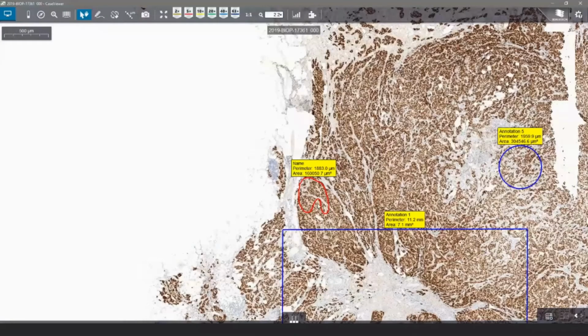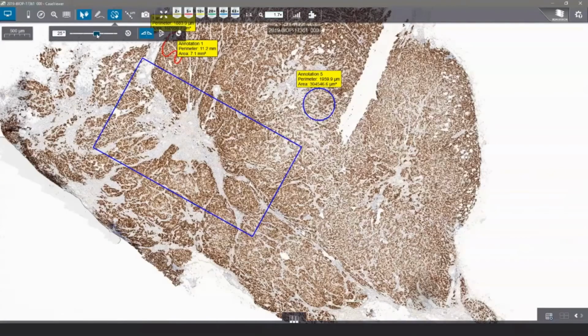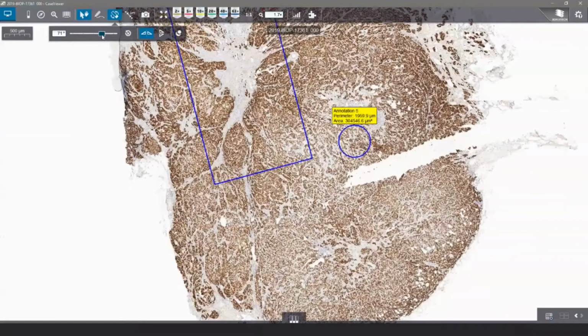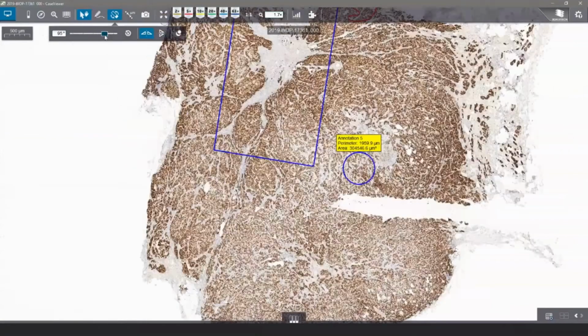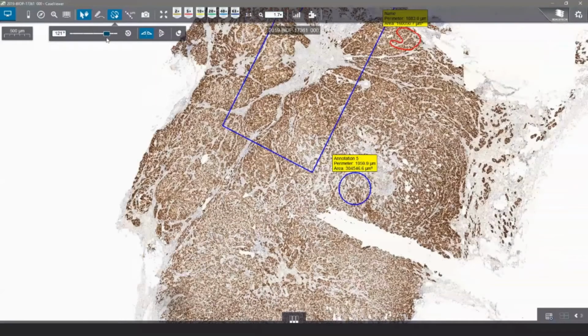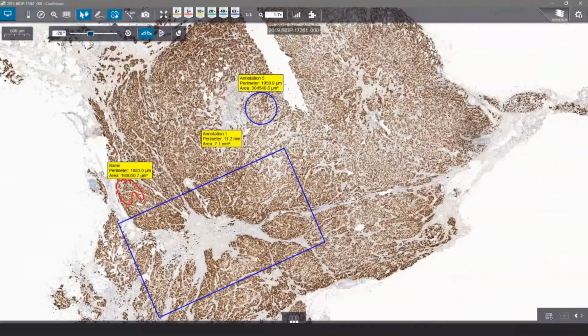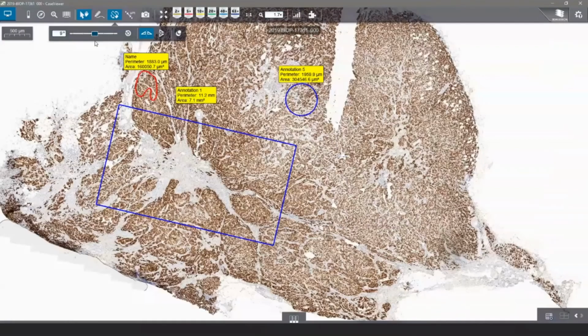After the annotation panel comes the slide rotation panel. Basically, here you can rotate the digital slide. I see that probably the video is lagging a little. Normally, this rotation movement and actually all the pan and zoom movements are quite a bit faster. Only the WebEx video makes this lag on the slide movement.